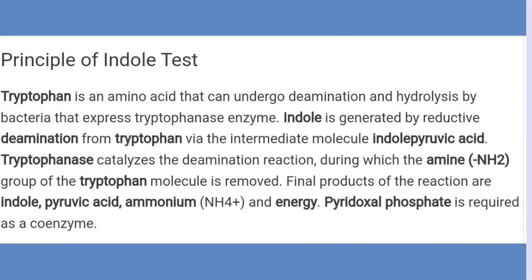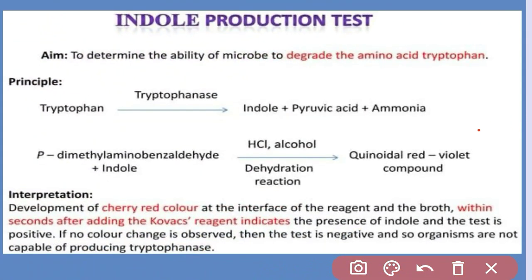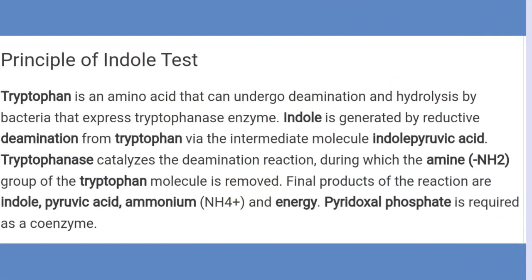Principle of the indole test: tryptophan is an amino acid, and this undergoes deamination and hydrolysis by bacteria. That bacteria secretes the enzyme tryptophanase.